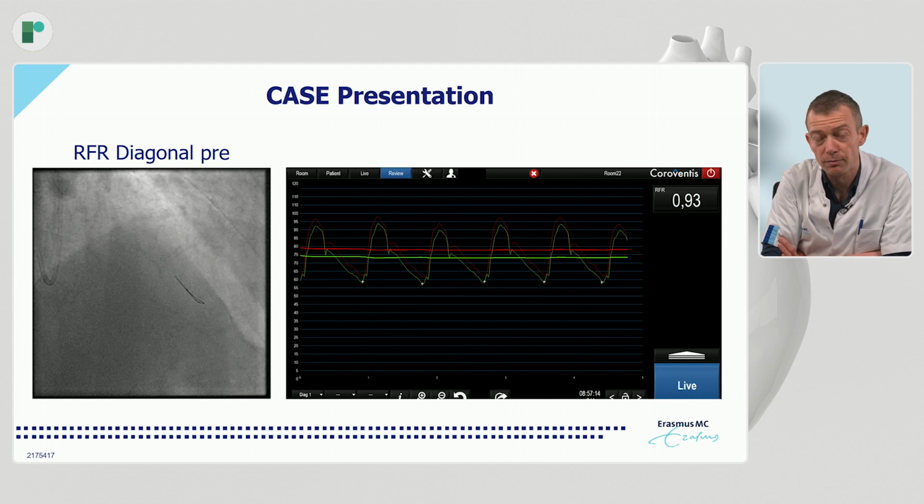Then we usually also measure the side branches. I think that is relevant, specifically if you upfront already want to decide on whether or not you want to embark on a bifurcation stenting strategy in a lesion that has a Medina of at least 101, but the side branch is typically very difficult to assess. We usually tend to overestimate the disease in the side branches, so I think that is something to really keep in mind. And that's where I think the physiology has specific merits.